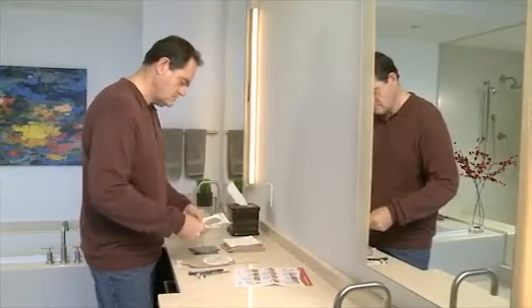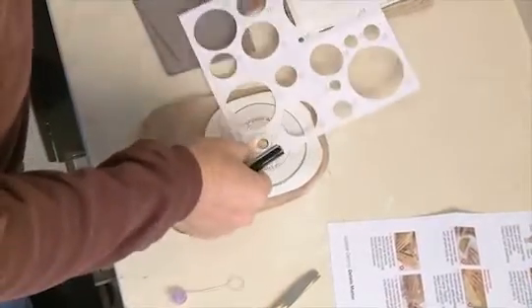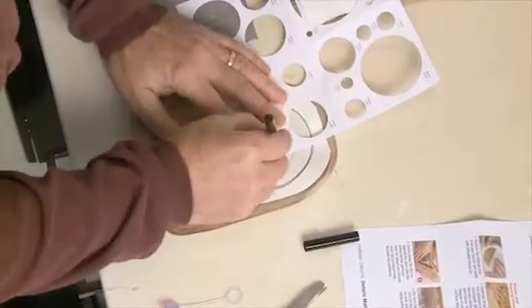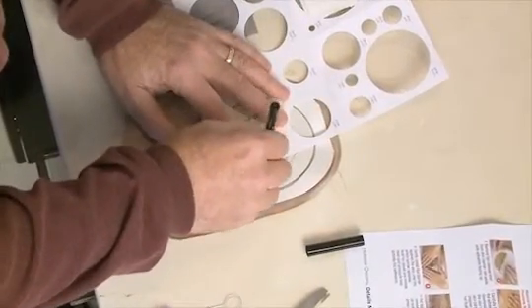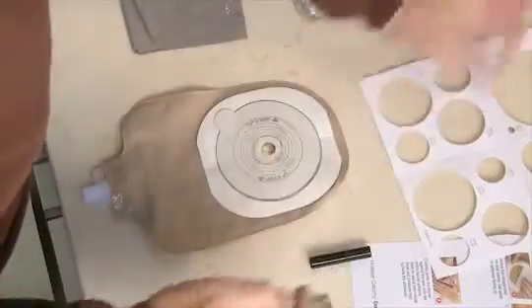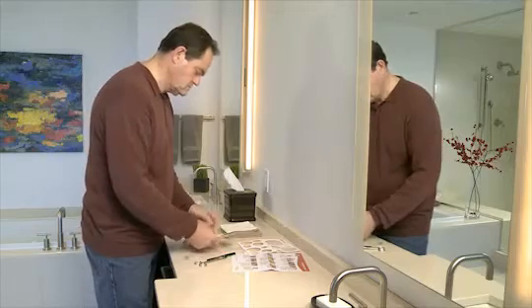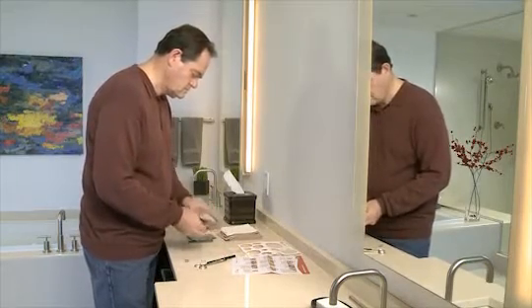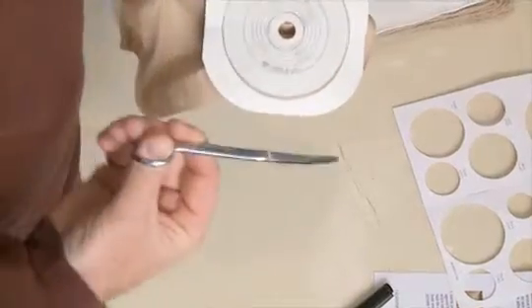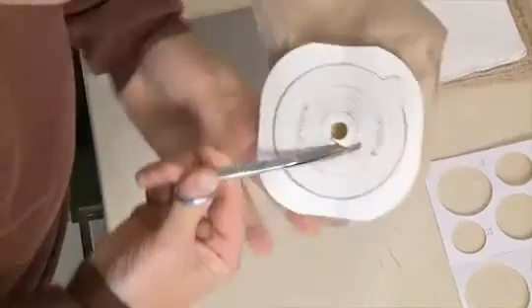After you've assembled all your supplies, you're ready to prepare your new pouching system. If you are using a cut-to-fit skin barrier, draw the pattern of your stoma onto the backing of the skin barrier. To avoid cutting the pouch with the tip of the scissors, simply pull the pouch away slightly, then cut the opening in the skin barrier. Scissors with a curved blade generally work best.